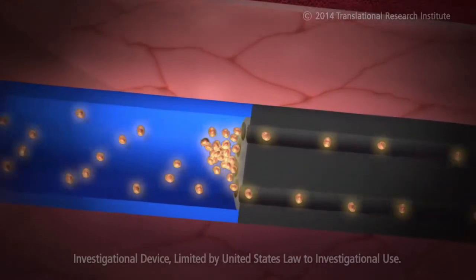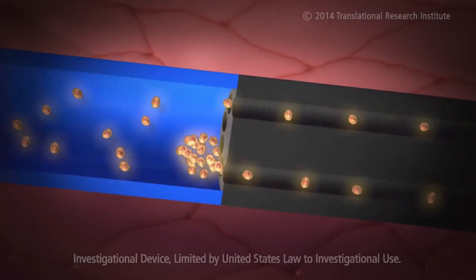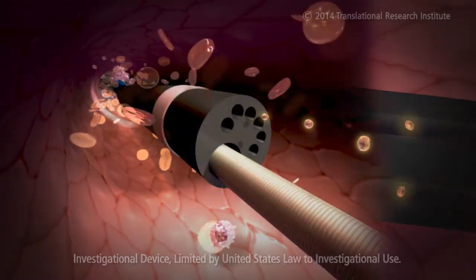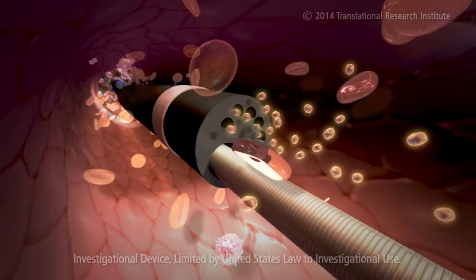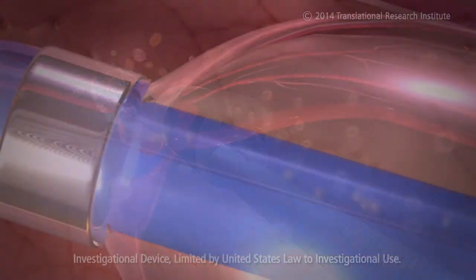The stem cells are separated through multiple channels, reducing the likelihood of clumping, leading to embolization and heart attack. This dispersion leads to better mixing of stem cells with the blood and potentially better tissue distribution.